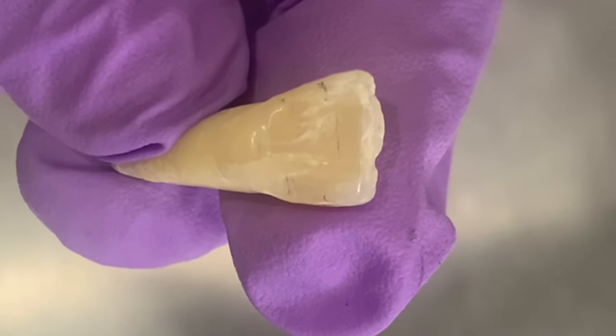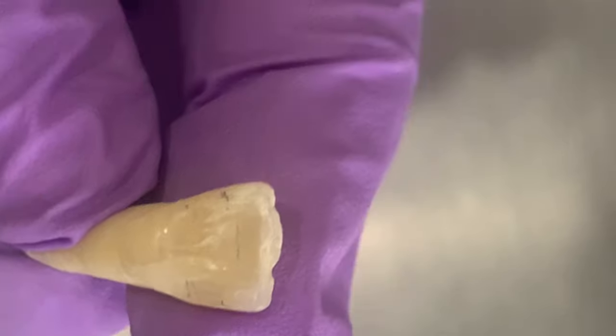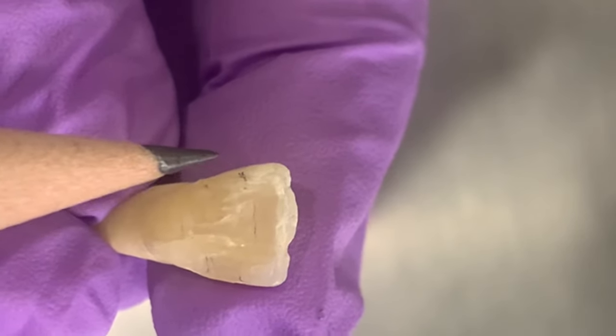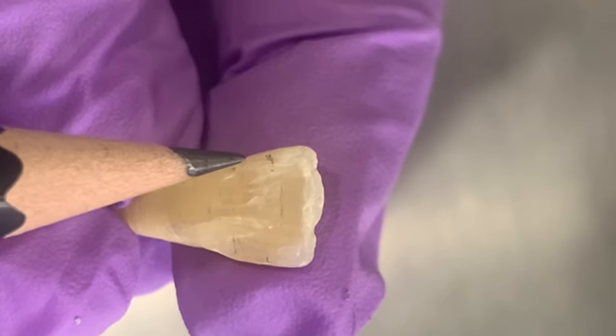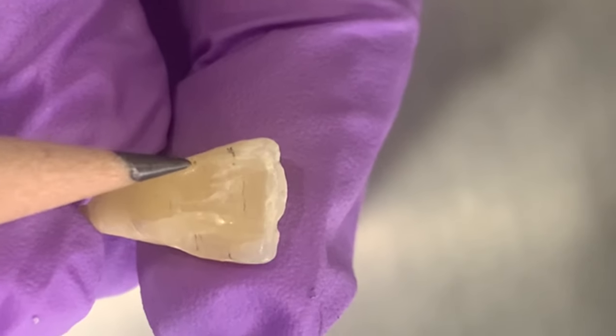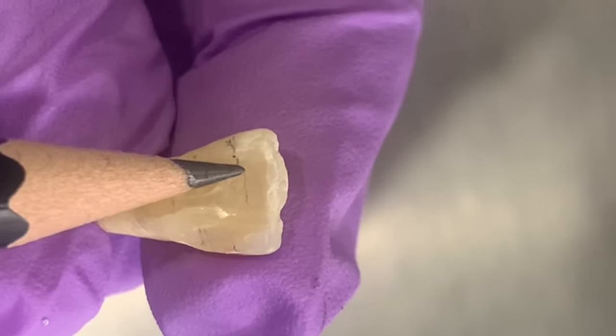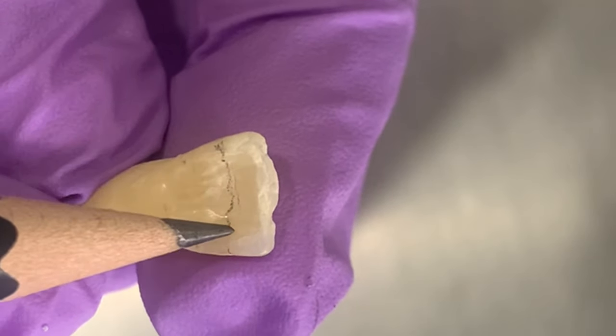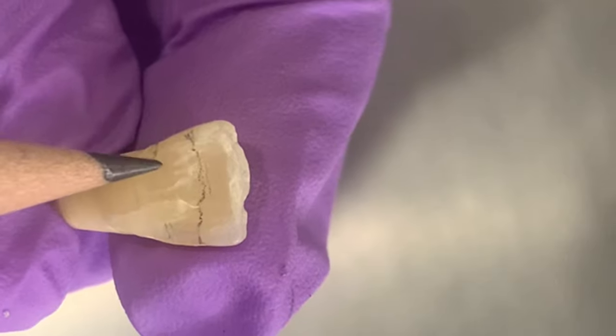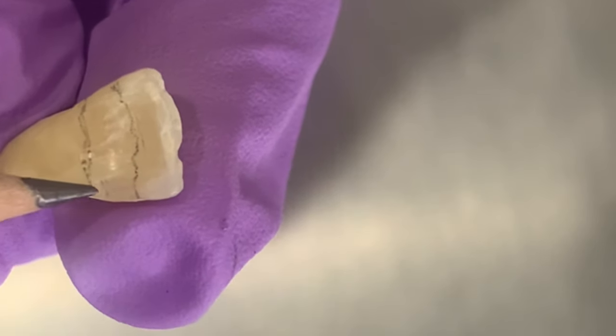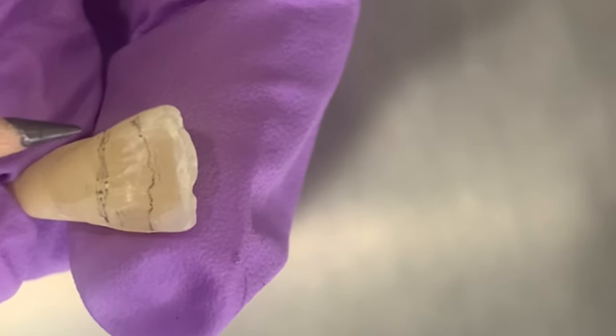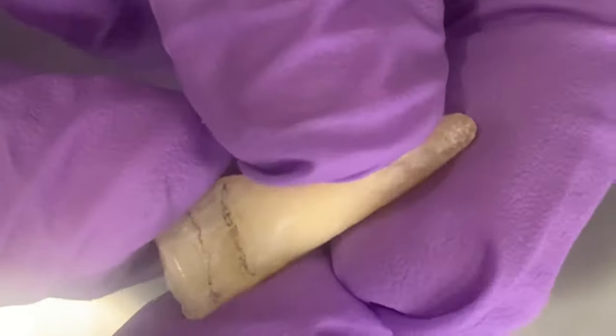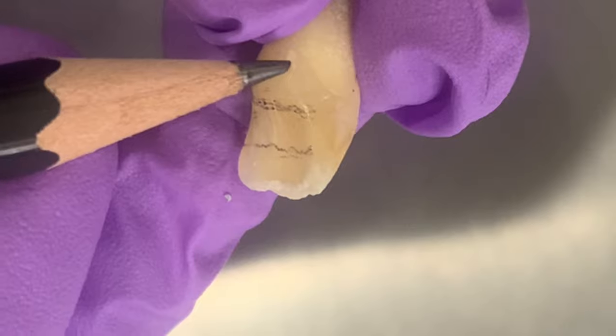Now how do we locate the exact point where we want to start the access cavity? For this purpose we divide the tooth into three parts by drawing two horizontal lines in this manner. So we have divided into incisal one-third, middle one-third, and cervical one-third.